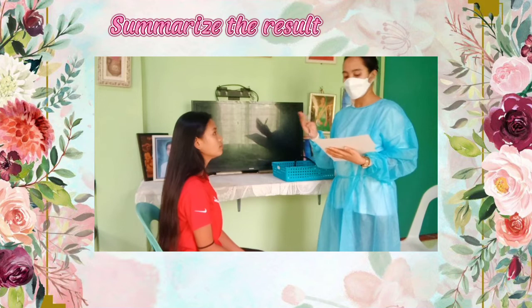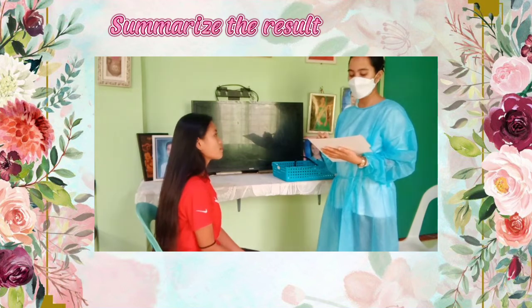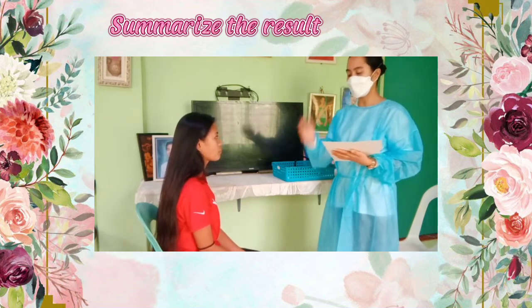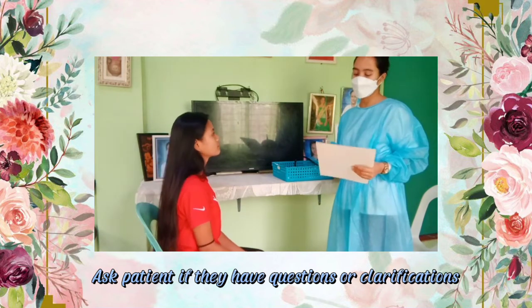For your respiratory rate, 18 breaths per minute. The depth of respiration is normal and the rhythm is regular. For your blood pressure, 106/85, and that is also normal. That's all for the results of your vital signs, ma'am.